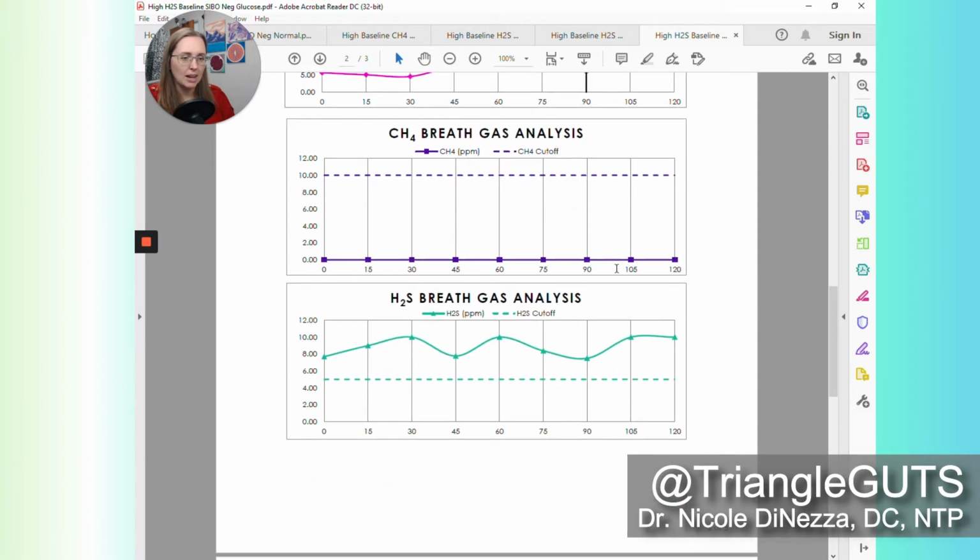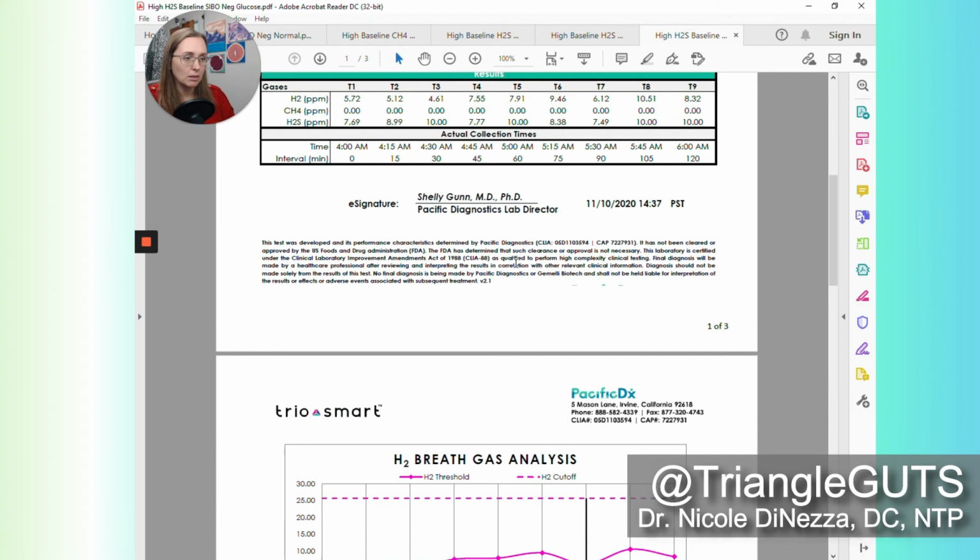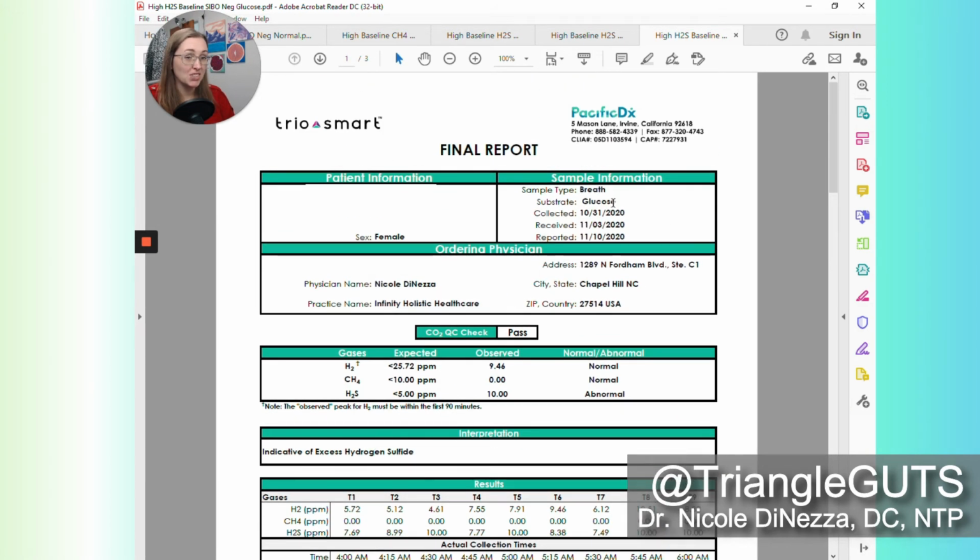We have a nice flat line for methane production, and then yet again, we have an elevated baseline, and then we get just the littlest of a peak here, and then it goes down, and then we're actually getting a little bit of a double peak scenario. For those of you who don't know some of the intricacies here, with lactulose specifically, we might expect a double peak because we could have a peak in the fermentation coming from the small bowel and then another peak coming from the colon. But if we scroll back up, remember this is glucose.